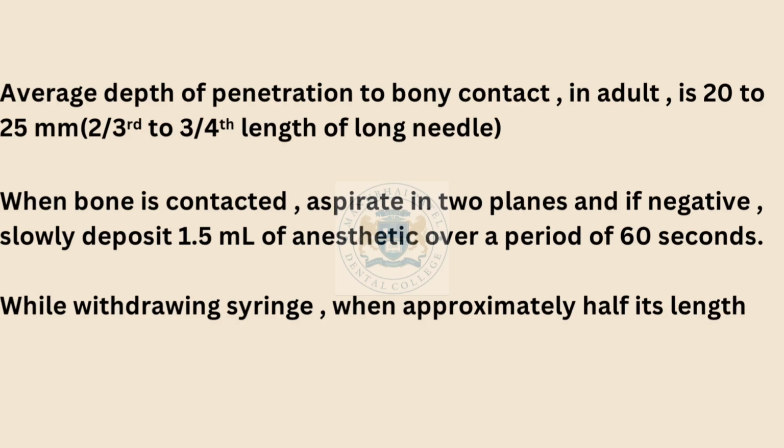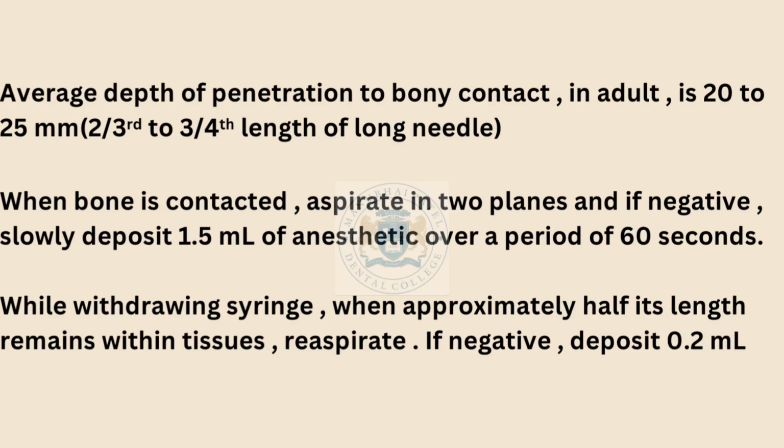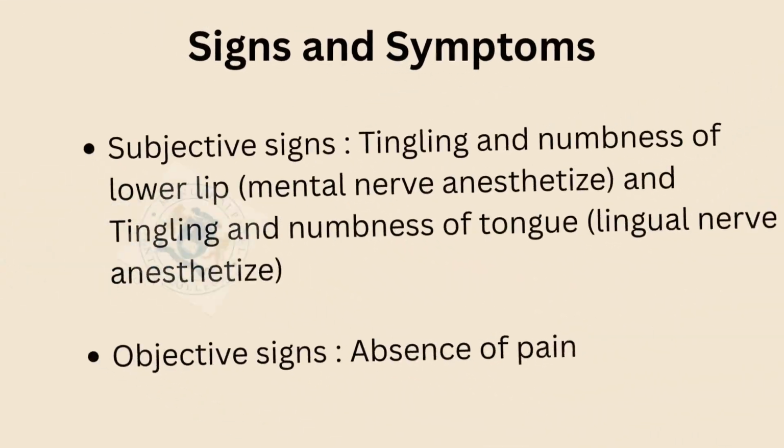While withdrawing the syringe, when approximately half its length remains within the tissues, reaspirate. If negative, deposit 0.2 ml to anesthetize the lingual nerve.